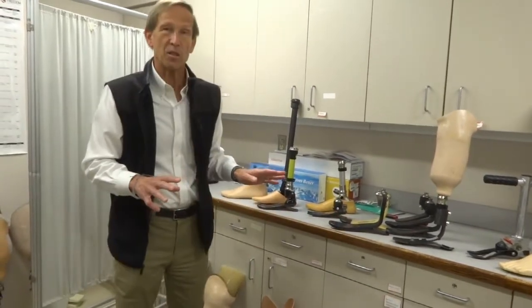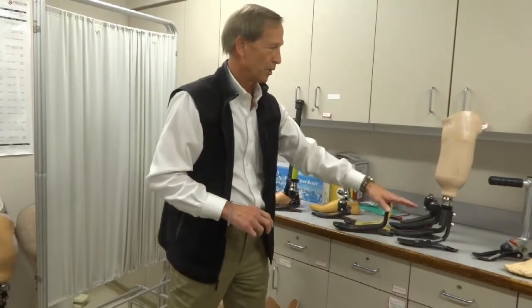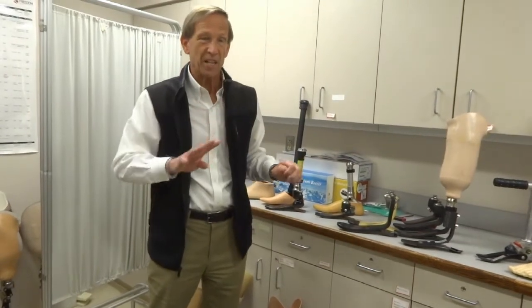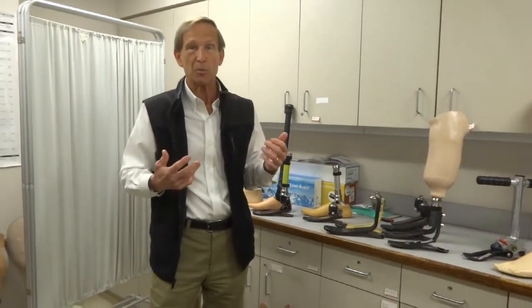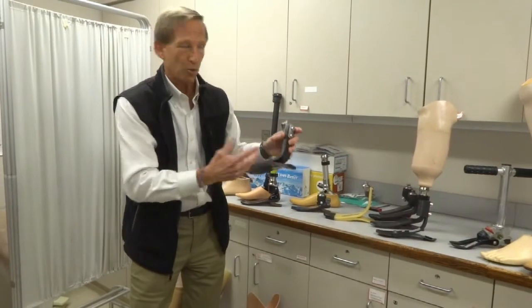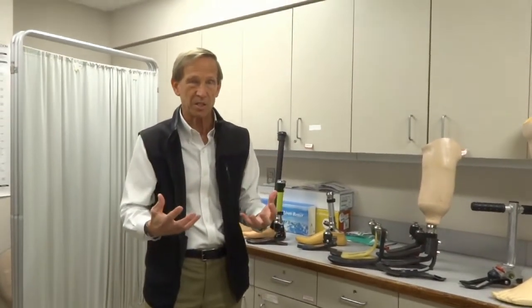There are other categories of prosthetic feet too. Category one, two, and three cover most people. There is a category four — a very high performance category, typically for sports, recreational activities, and work. As you've seen, some people who run on TV have a sprinting type of foot with a long carbon strut but no heel plate at all. Category four is for those high-level sports or activity-specific feet.